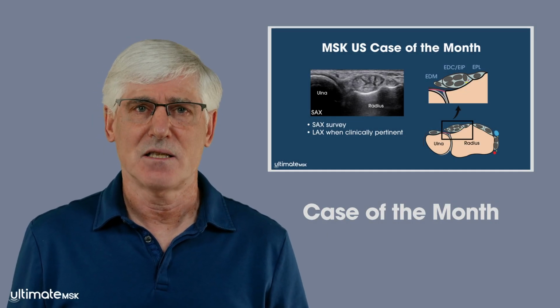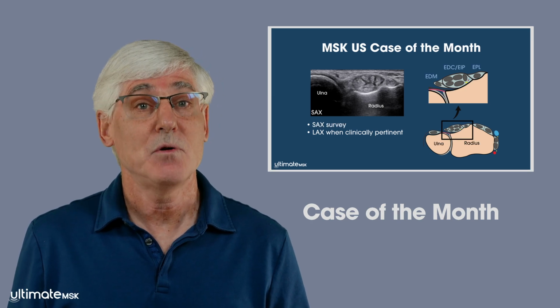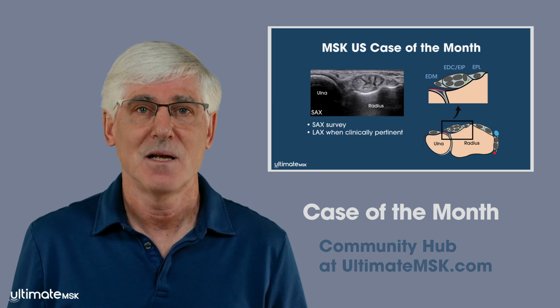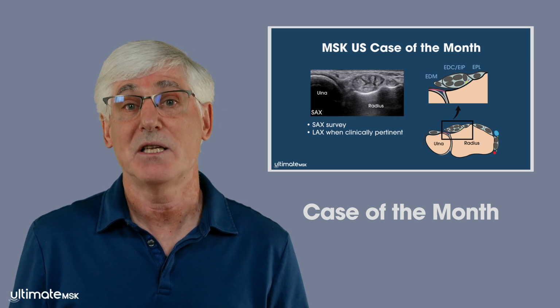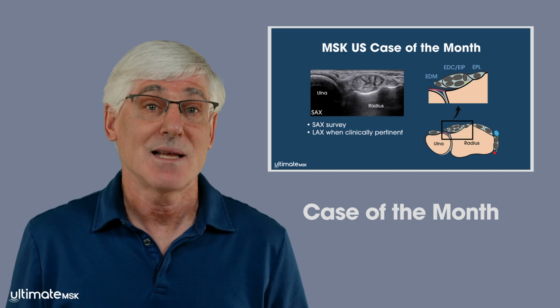The last two cases involve pathology related to the carpal tunnel, which can be reviewed in the Community Hub and ultimatemsk.com. This current Case of the Month evaluates a painful dorsal wrist mass with the dynamic capability of ultrasound solidifying the diagnosis. Let's get started.